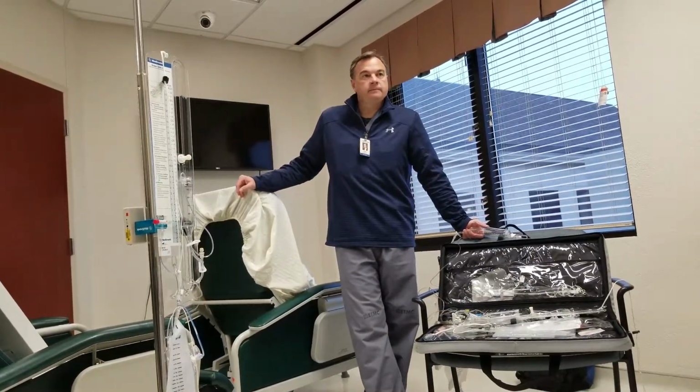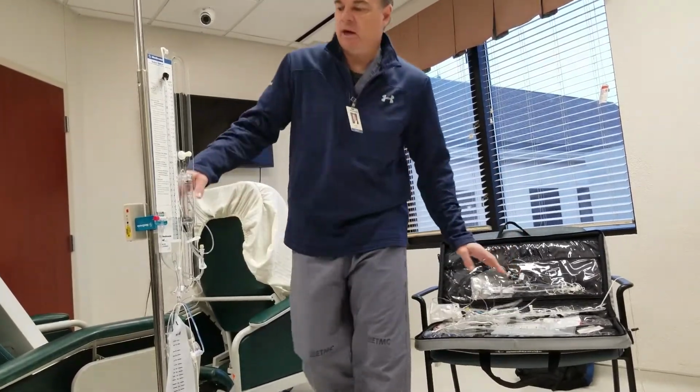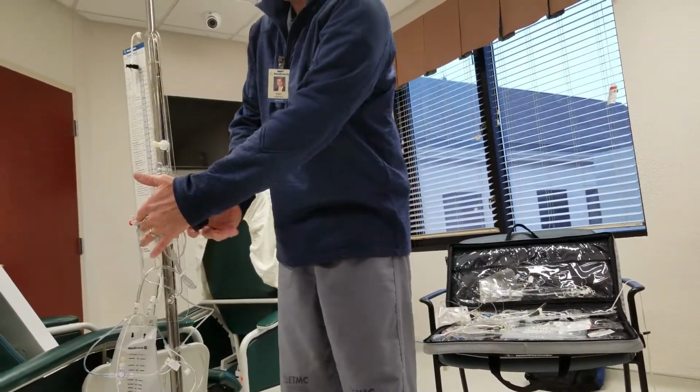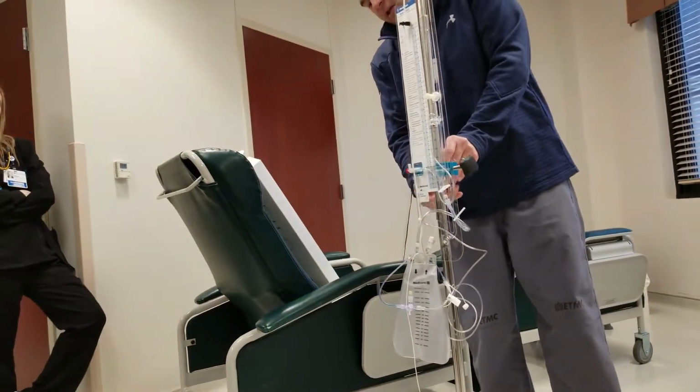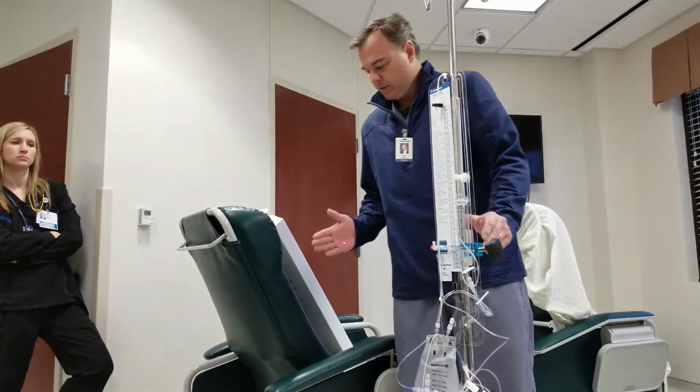It has to work to go. It's going uphill, the tubing is uphill. So this is the way it goes. It looks here, it starts here. This little laser light helps. Some people don't need it, some people do.